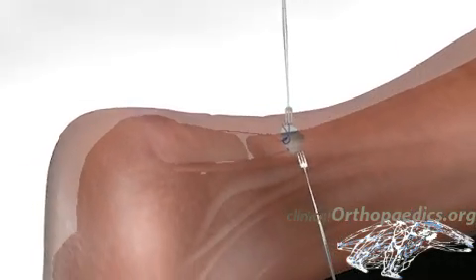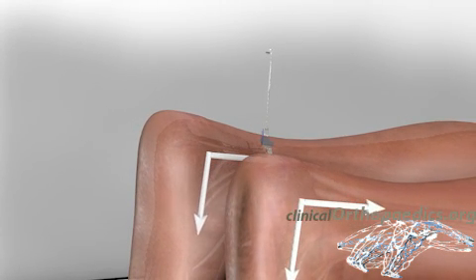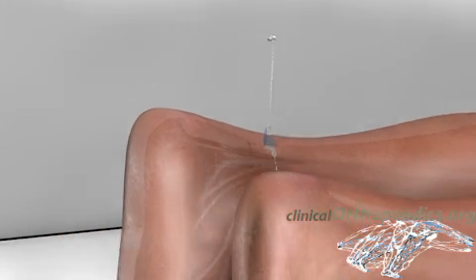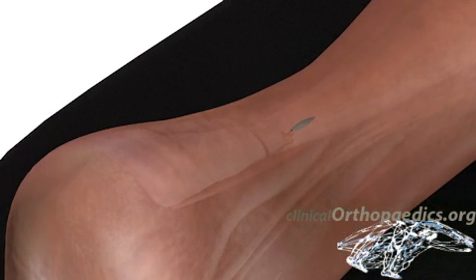The suture knots are tightened so that the ankle's plantar flexion equals the non-injured side. Finally, the fascia, subcutaneous tissue, and skin are successively closed.